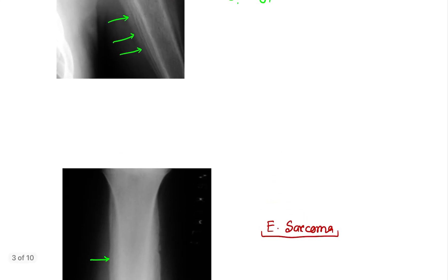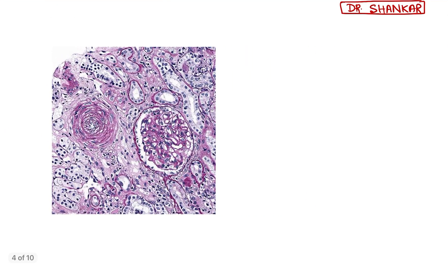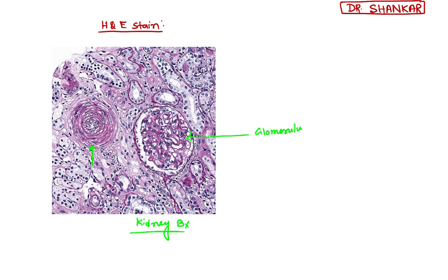Next, coming to another image — our second image. This is a biopsy image, a hematoxylin and eosin (H&E) stain image showing onion skin peel appearance. This is a kidney biopsy specimen. Here you can see the glomerulus, and this is an artery with vascular smooth muscle proliferations around it.